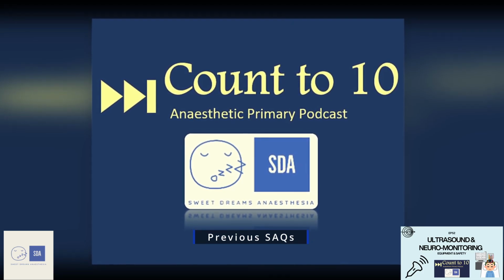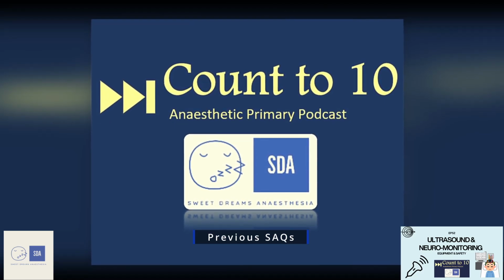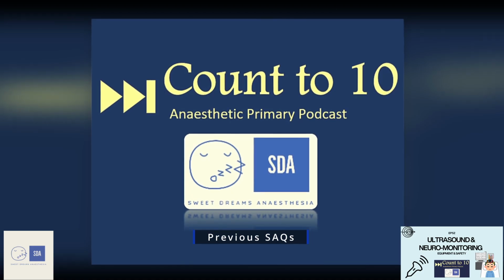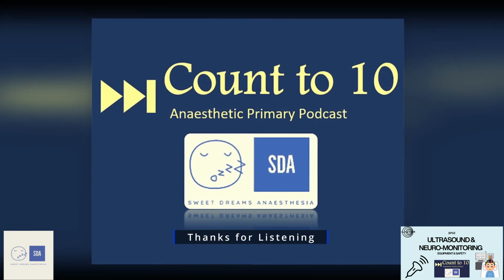And if you just do this calculation once, it might not be an accurate representation of the cardiac output. So you can increase the accuracy by repeating these measurements 3 to 5 times to ensure that you're actually representing the patient's cardiac output. The other advantage of this technique is that it's non-invasive to the patient, which I think is a really important thing to put into your answer.